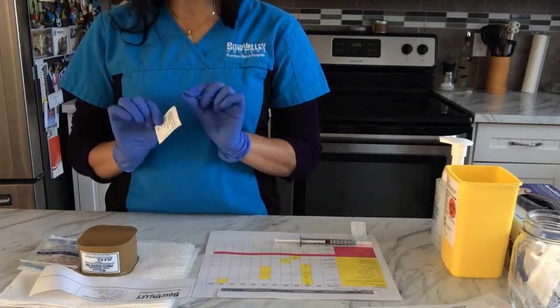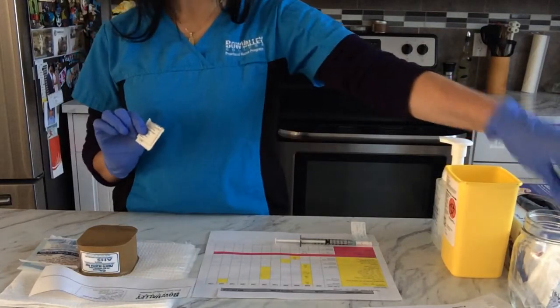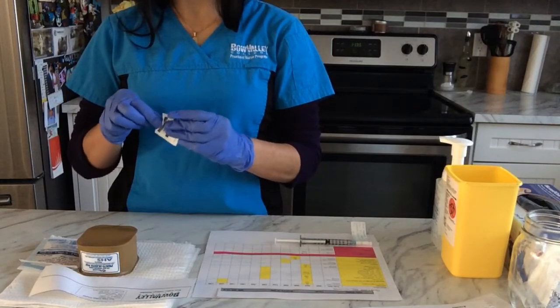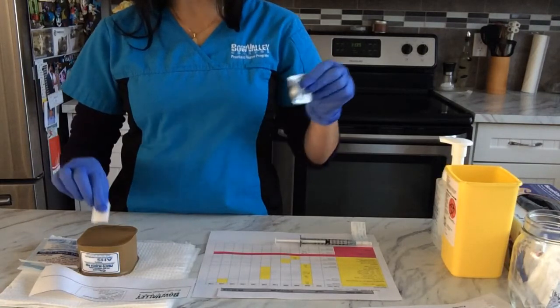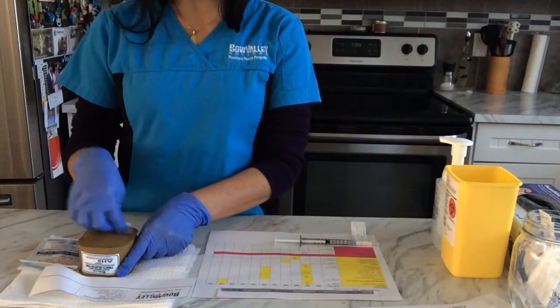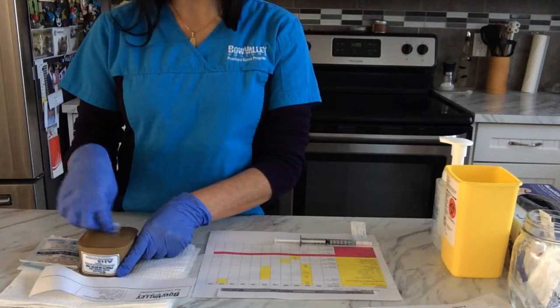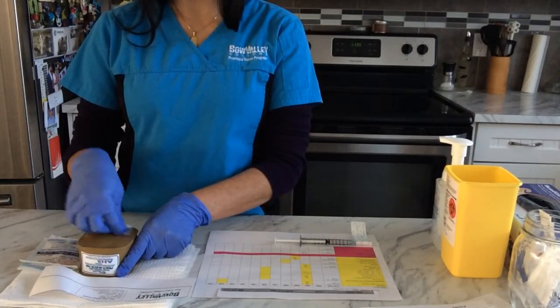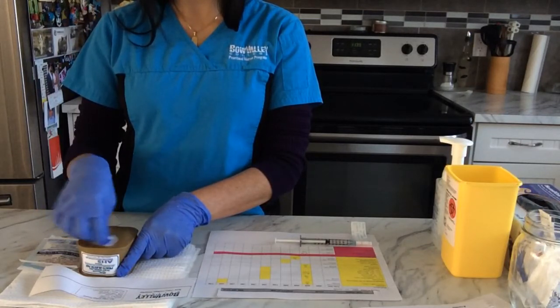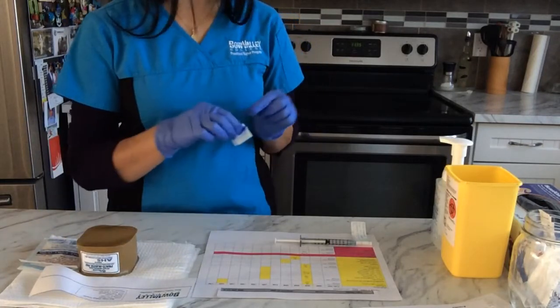So first I will clean the site. I'm gonna start in the middle, from the center towards the outside. I will clean the site for 30 seconds, and I will let it air dry.